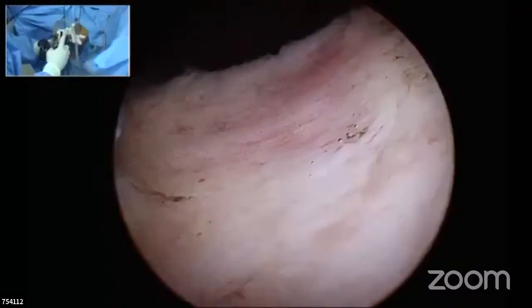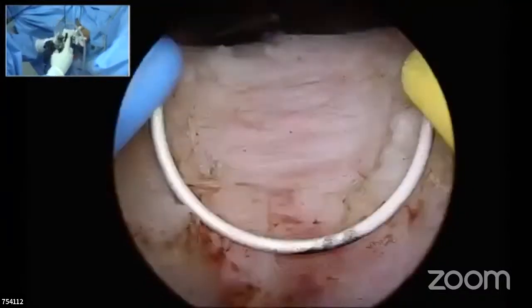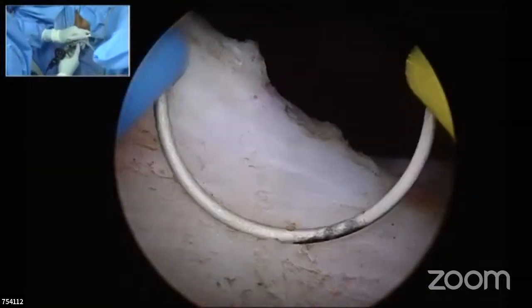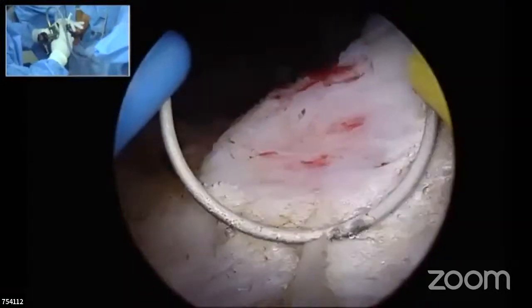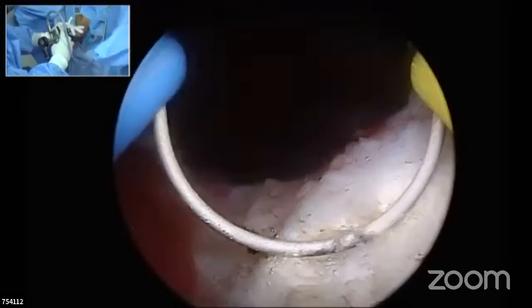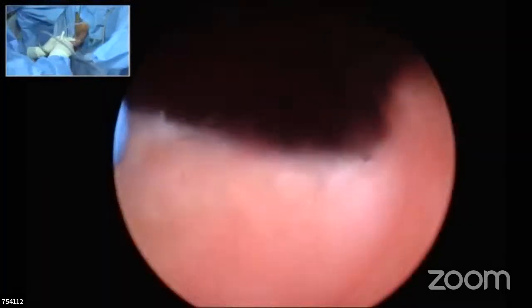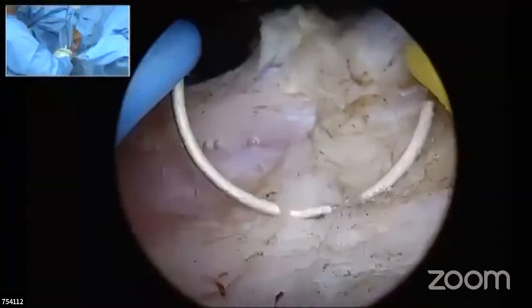I have not opened the plane between the bladder and the prostate. This is the plane which can get opened, as Dr. Deepak Pekar sir was telling. Looking again at the arteries at 4 o'clock and 8 o'clock, which supply the median lobe area, this is the blood vessel, and coagulating it, and looking for the 1 o'clock arteries, which are the major suppliers for the prostate, which have already been coagulated.